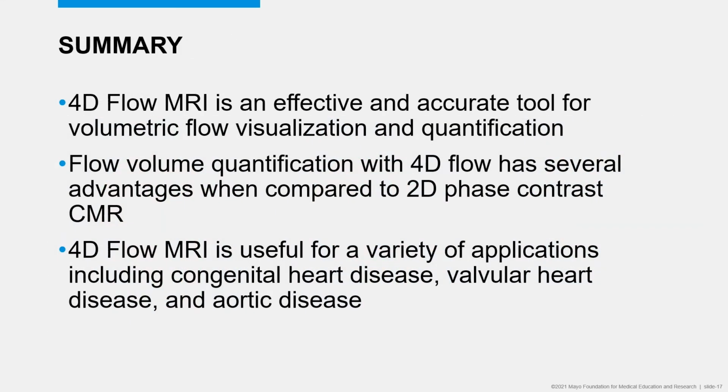So, in summary, 4D flow is an effective and accurate tool for volumetric flow visualization and quantification. Flow volume quantification with 4D flow has several advantages when compared to conventional 2D phase contrast imaging. And 4D flow MR is useful for a variety of applications, including congenital heart disease, valvular heart disease, and aortic disease.